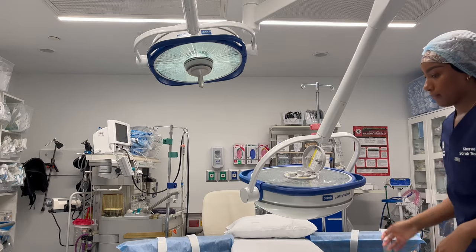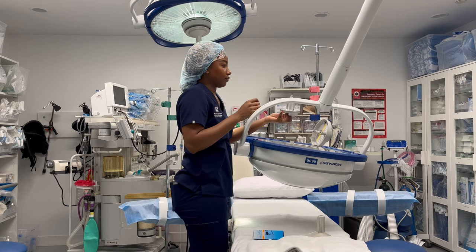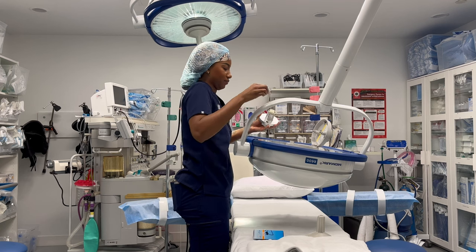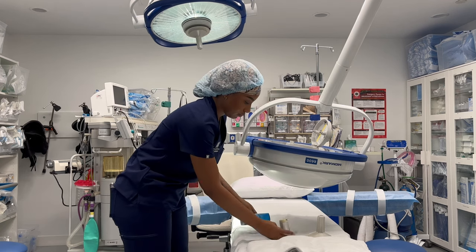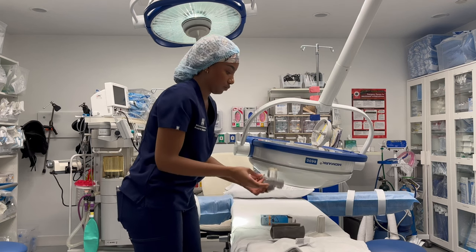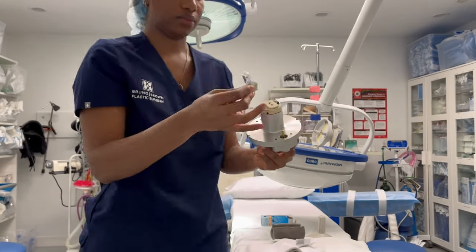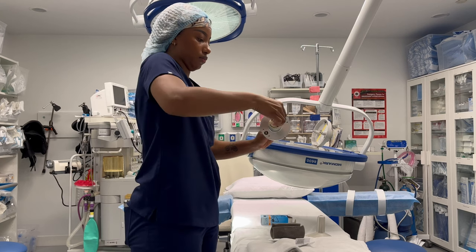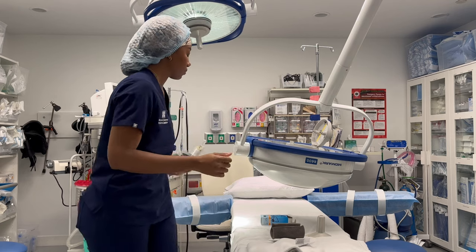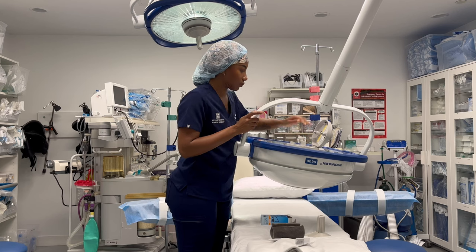I just unscrew everything, take the bulb out, go get a new one, and swap it out. It's not really that hard. It's just like changing a light bulb at home. They have these little halogen bulbs, and I just swap that out. I'm going to show you guys what that looks like in a second. That's literally that little bulb that's illuminating the entire OR, well, the surgical site. So I do that, and then I screw it back on and put it back together, and that's really it.